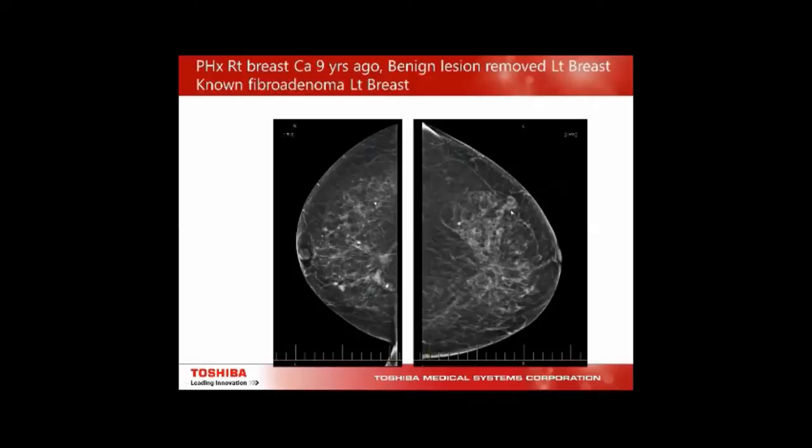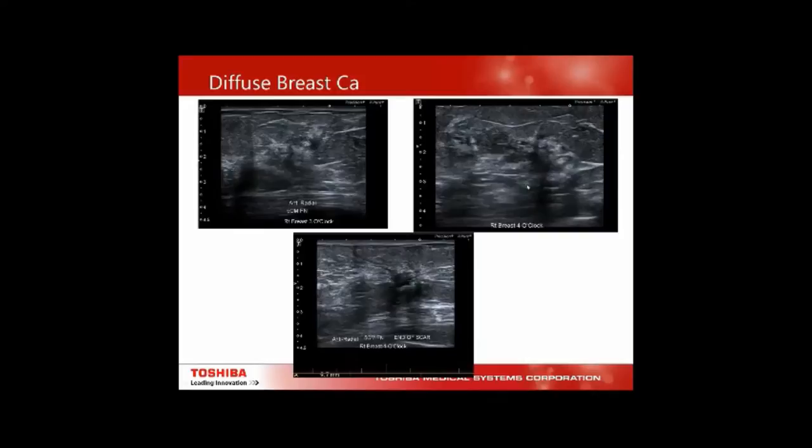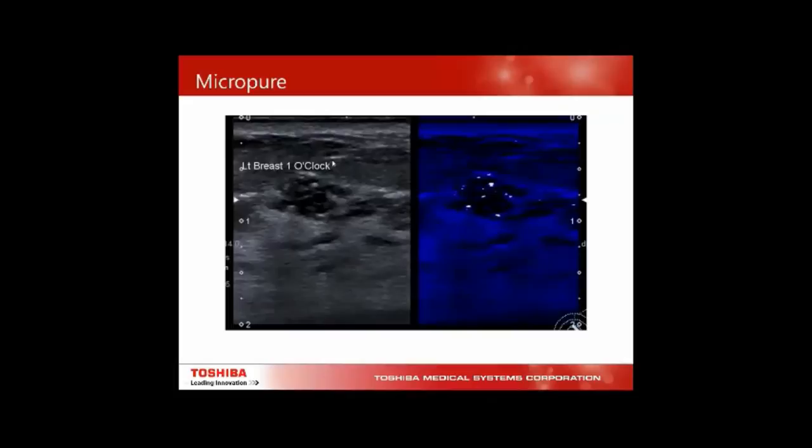This area is where we're looking; over here is where the breast cancer surgery was done, and this is a fibroadenoma in the other breast. Coming through here, we can see that the ducts from another view are discontinued. At the end of the scar tissue was a non-cancerous area, but this region was confirmed on biopsy to be a breast cancer.